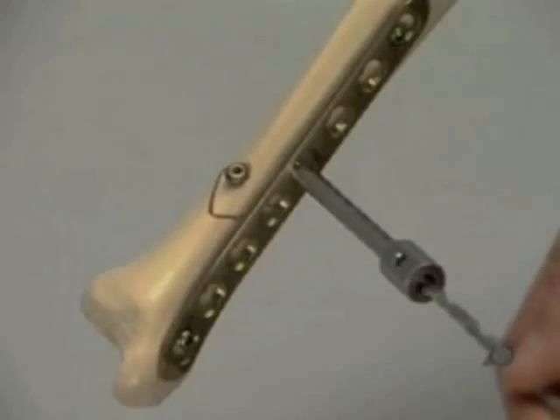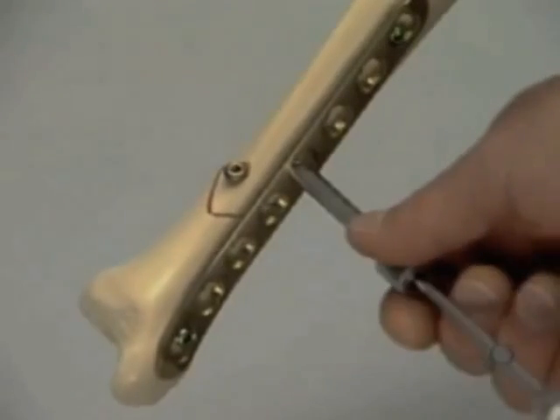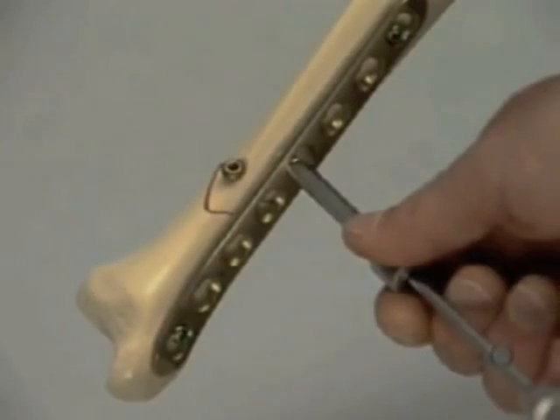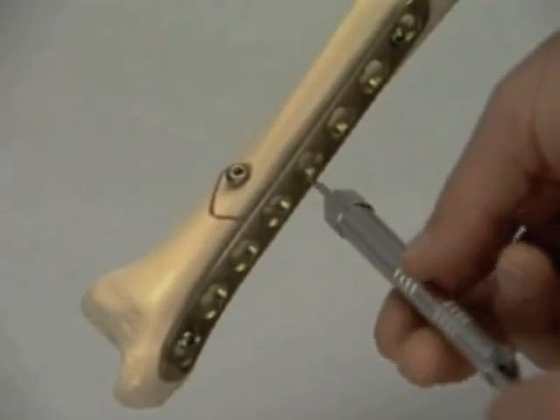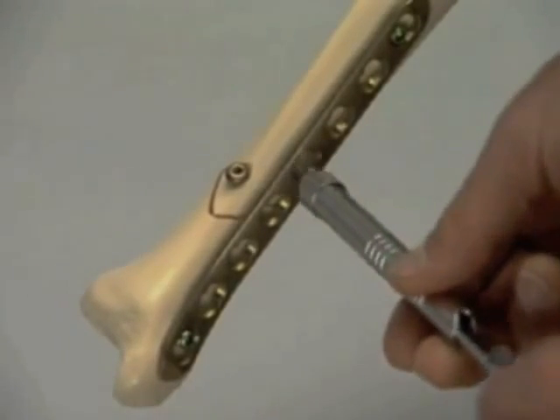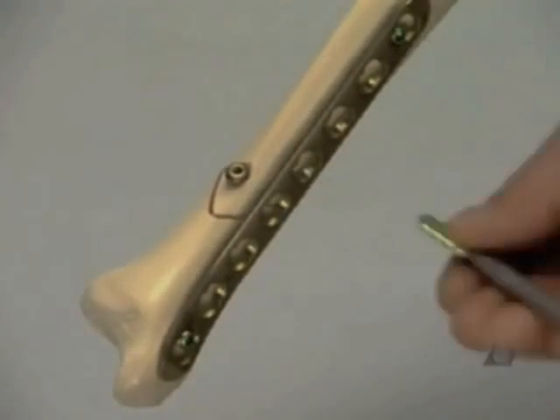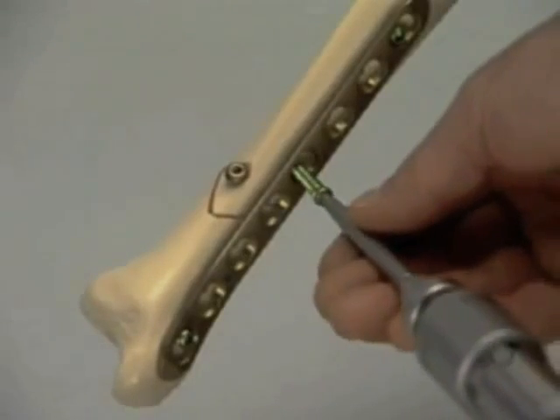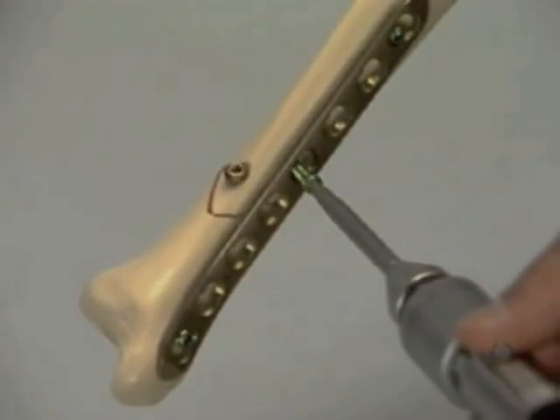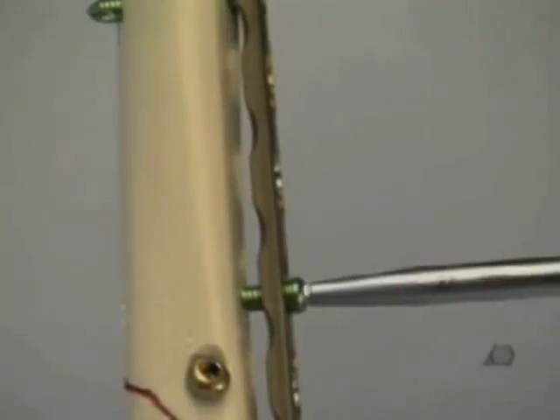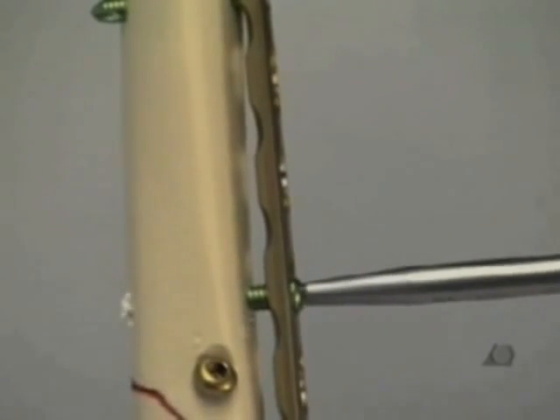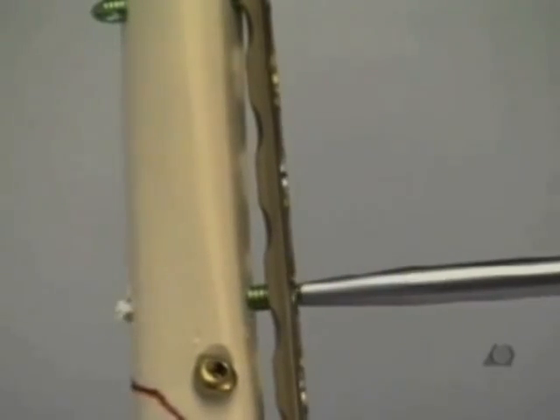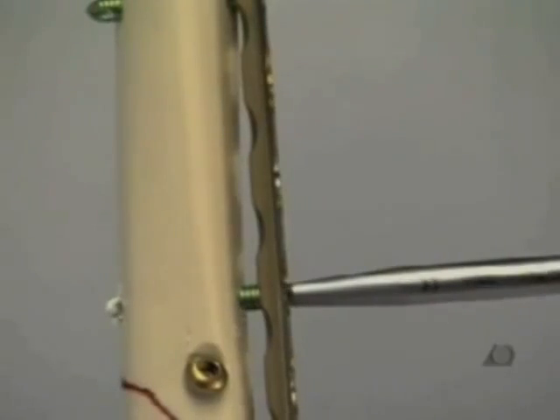The hole for the second bicortical screw in the proximal fragment is prepared. The screw length is measured. The appropriate screw is inserted. It's clear that the plate is not pressed against the bone, leaving a gap for the periosteum and healthy tissue in growth.